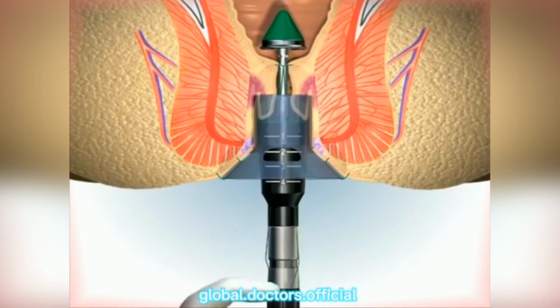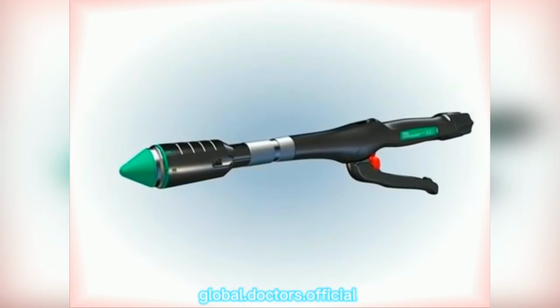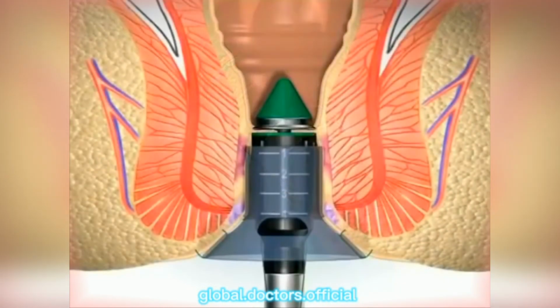The stapler is then partially closed, advancing the stapler housing into the anal canal. The stapler housing of the hemorrhoidal circular stapler is longer than in conventional circular staplers, and is provided with centimeter marks on top to facilitate its positioning in the anal canal.